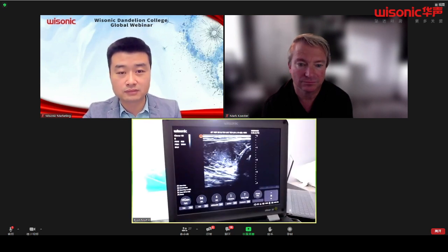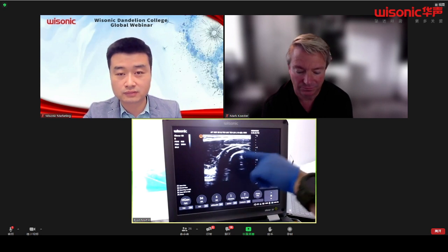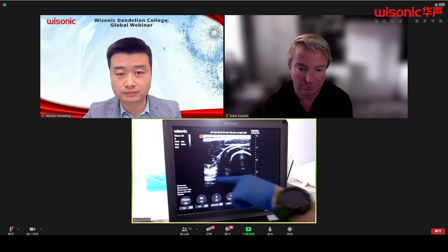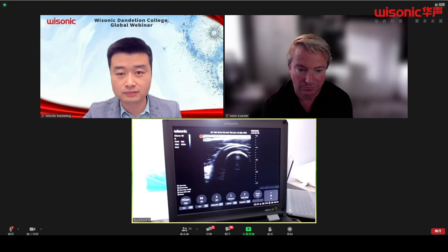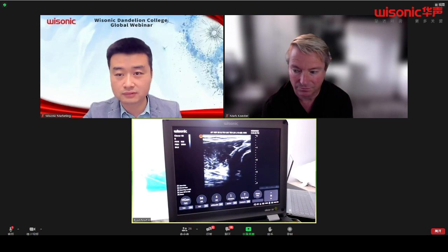All right. So from here, I'm looking for the radius, which is this circular component right through here. As you can see, off into the distance here, those are our fibers of the biceps right in there. There's a good picture of it. Hopefully you guys see this as well as I do. It's hard to tell sometimes what you guys are seeing and what I'm seeing. And there it goes right under the radius here.